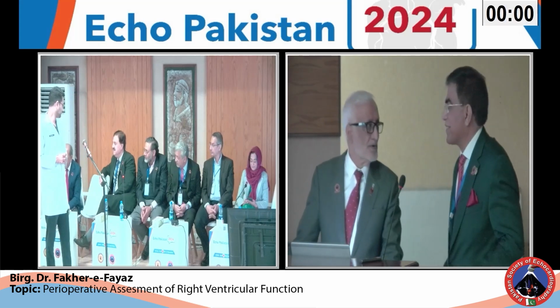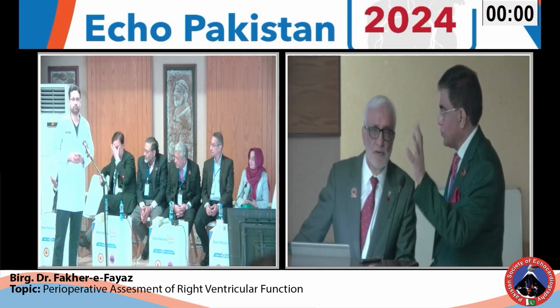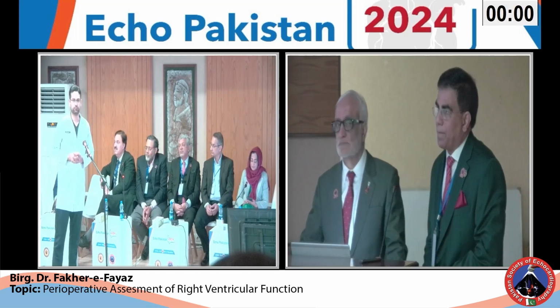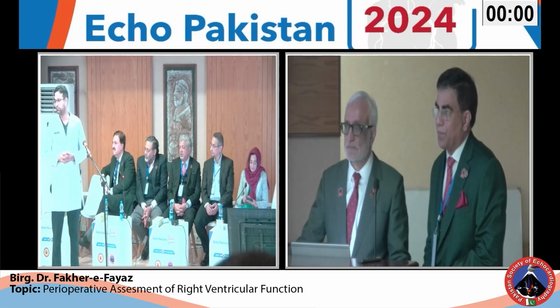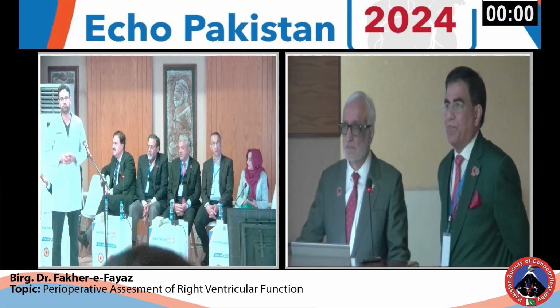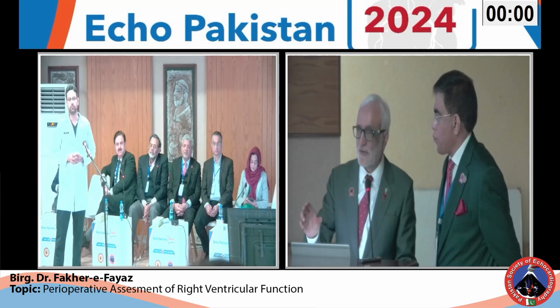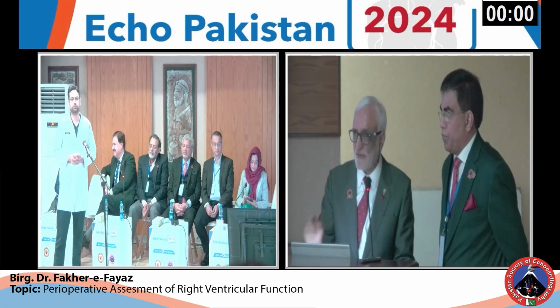She asked me yesterday, and I told her that this is not the anatomy we are seeing, this is the physiology we are seeing. So if the RV is functioning as LV, we will take it as LV, physiological LV. No, we are not taking the thickness into account. We are taking the E velocity and A velocity and all these things. So Tipu can comment on that. I think this is an interesting question, but logically it appears it would be different if it's the functional left ventricle and not the right ventricle.